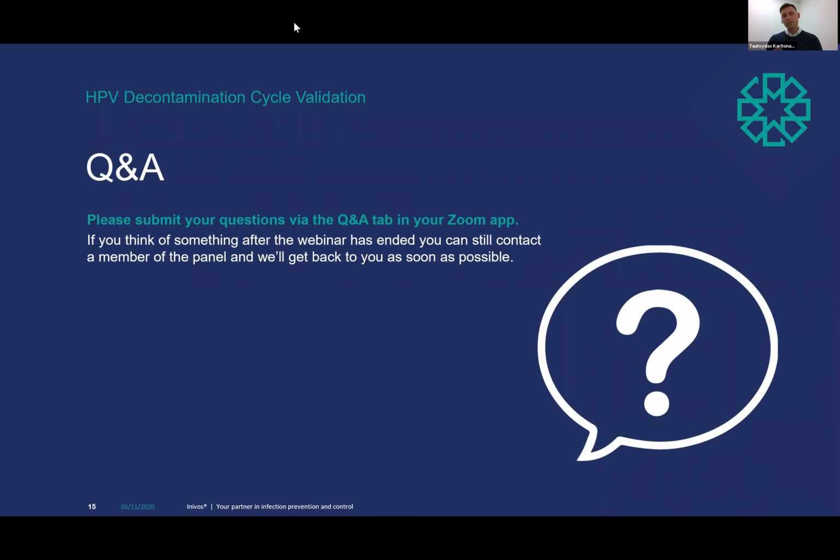Yeah. And just following on from that, I think Enrico had mentioned the two different modes of action, and whether we try to get the efficacy using gaseous phase or condensation, which is likely, as most processes do end up condensing on the surface. Well, once we know the right amount of hydrogen peroxide you need to achieve the right level of efficacy, once it's done the killing, then you go over to the deactivation phase. So in essence, the less hydrogen peroxide you have to deal with after, the better.